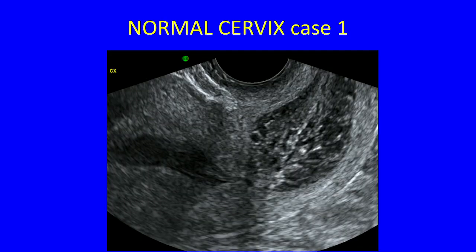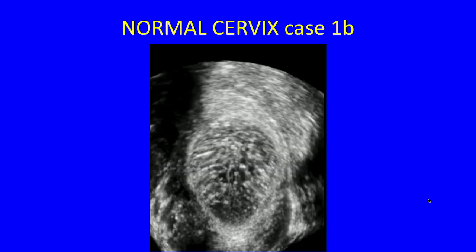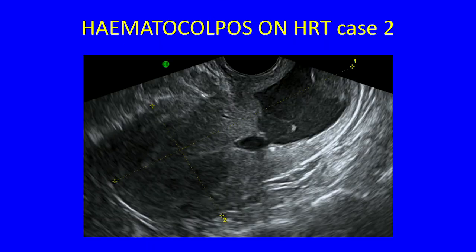Looking at the cervix, sometimes the cervix looks really unusual, and this is an appearance I've seen a few times now in young women, where it looks like this. Otherwise there's nothing going on, pretty asymptomatic. It tends to be an incidental finding. And on 3D, that looks like this. There's that cervix, and this is just the arbor vitae of little endocervical glands secreting mucus. So this is a completely normal cervix, but it looks reassuringly normal on 3D.